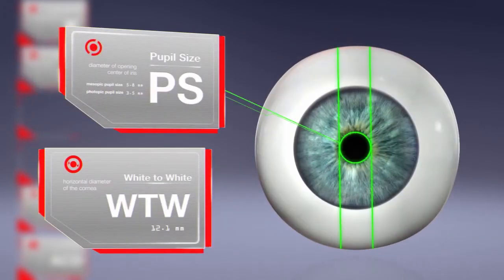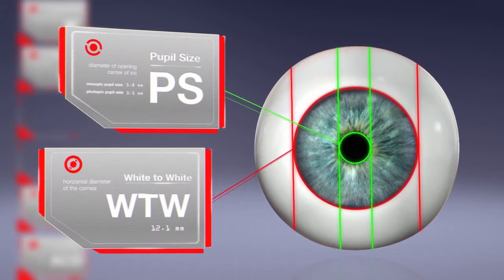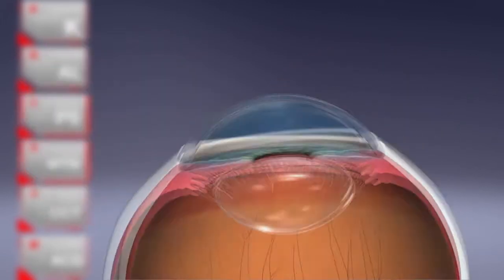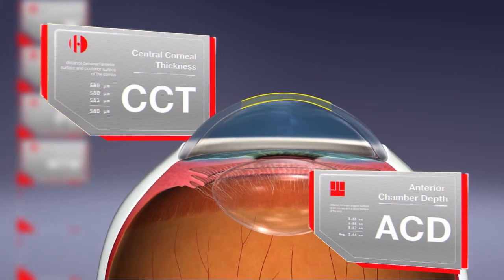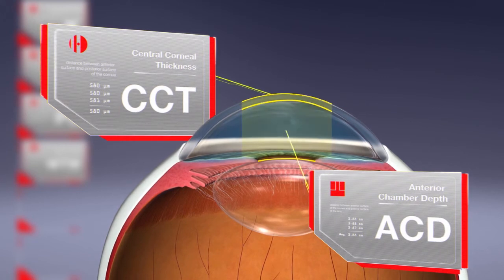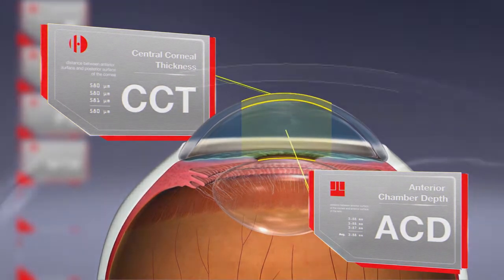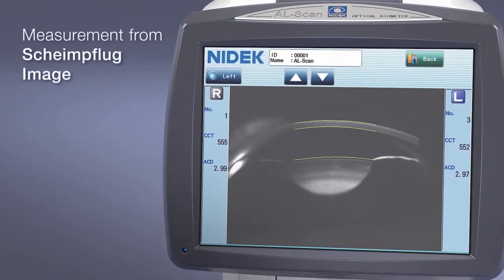Pupil size and white-to-white distance are measured using the captured image. With Scheimpflug imaging of the anterior eye, accurate measurements of central corneal thickness and anterior chamber depth can be obtained, and those measurements can be verified on screen.